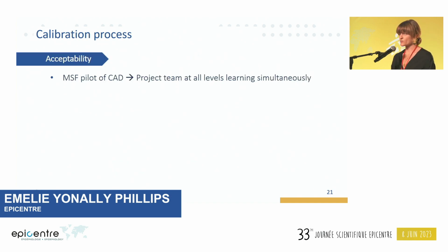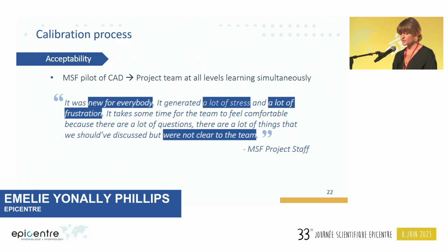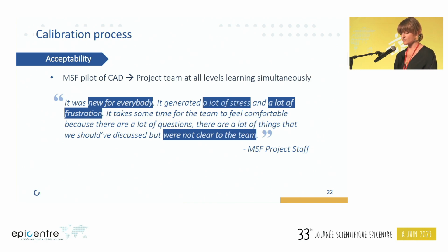Qualitative findings around user acceptability were also considered for the calibration process. As this was a pilot of CAD for MSF, it was new for everyone at every level of the project, including those coming out to train and support the team who were still learning about CAD capabilities during the process. This was described as initially generating a lot of stress and a lot of frustration because it takes time for the team to feel comfortable, and there are a lot of questions, a lot of things that were not clear.